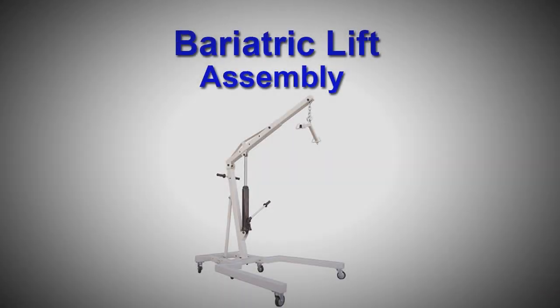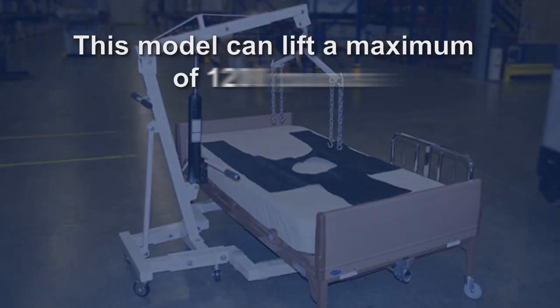A patient lift is designed to enable caretakers to effectively and easily move a sick person. This model can lift a maximum of 1,200 pounds and is primarily designed for obese patients.